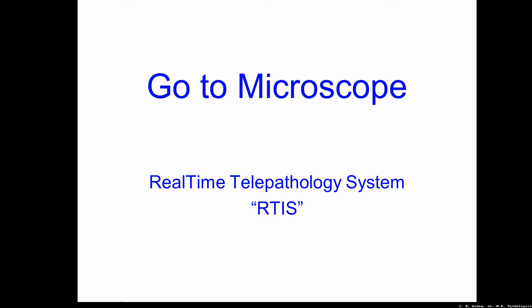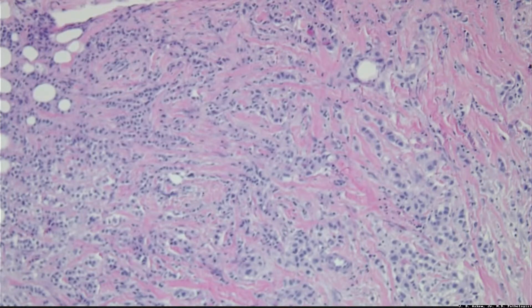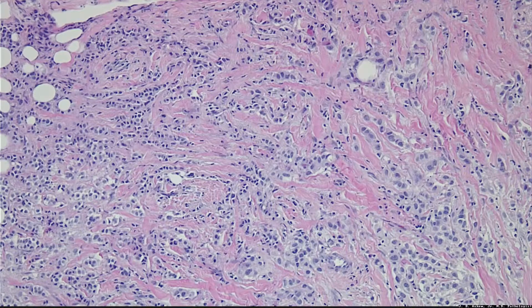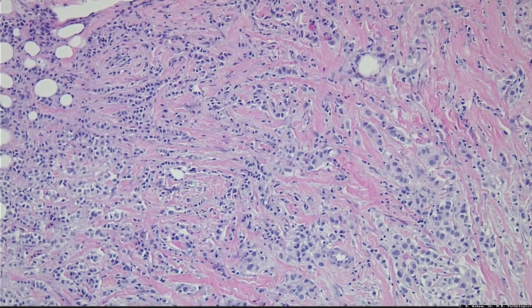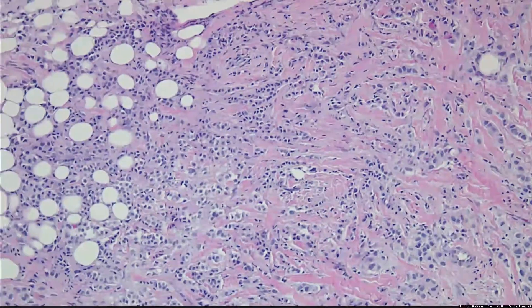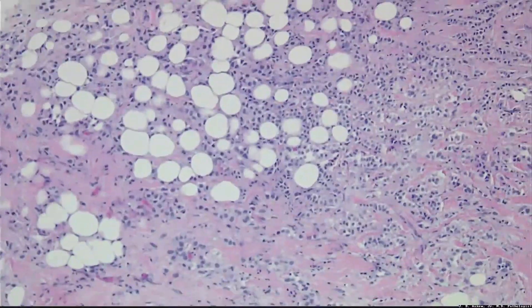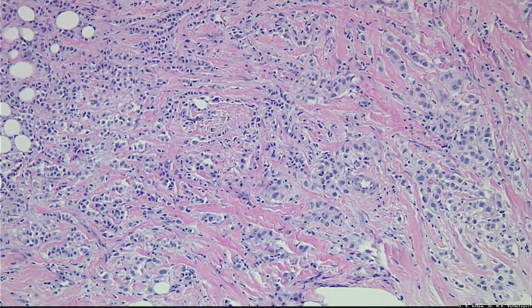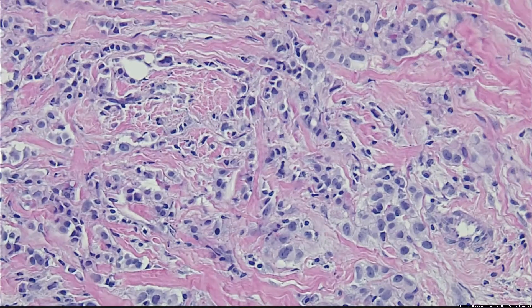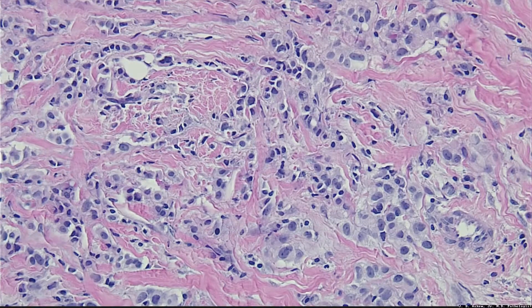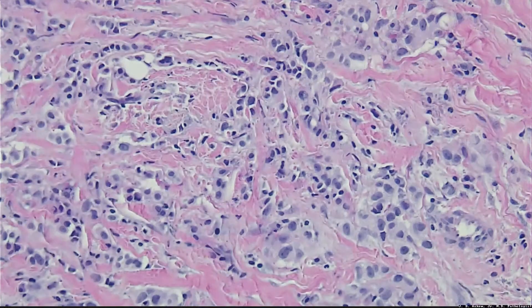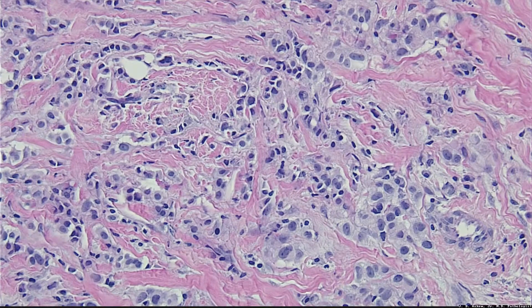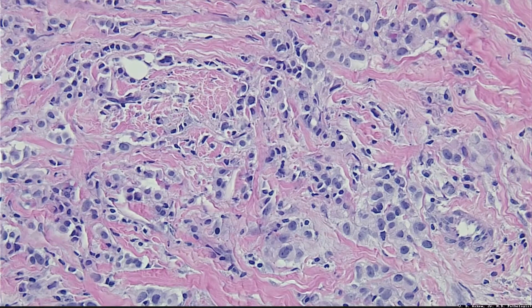Now we go to the microscope using the RTIS system. What we're looking at in focus is infiltrating carcinoma of the breast, and this is real-time HD video. We carefully move the slide around to demonstrate the tumor growing in fibrous tissue and between fat. At 200x, the image is nicely in focus, demonstrating nuclear detail, which is important to the pathologist. I'm also focusing up and down, which pathologists like to do when looking at cell detail.